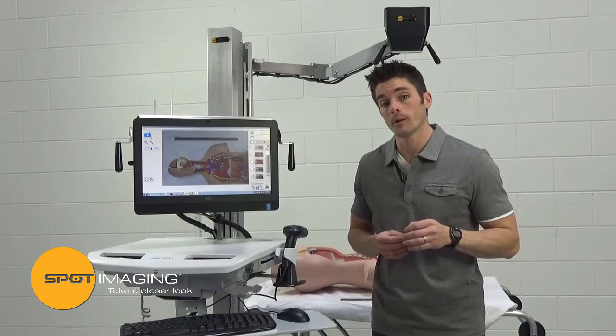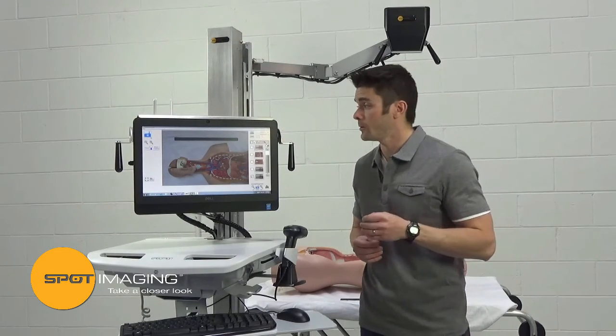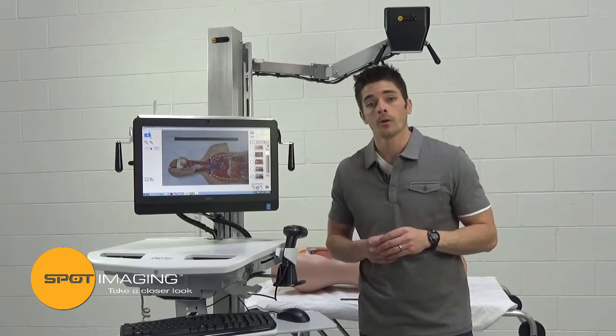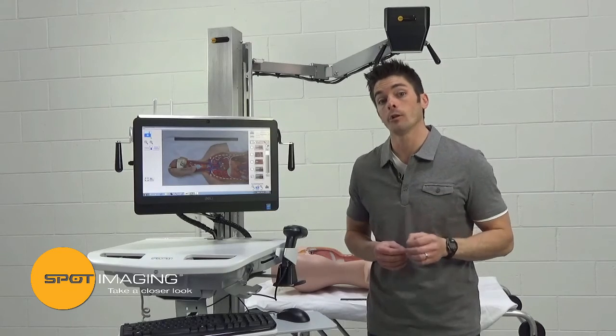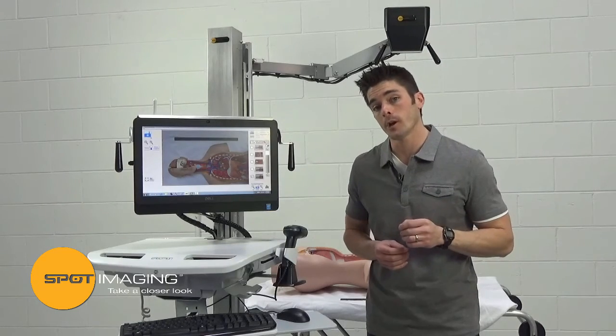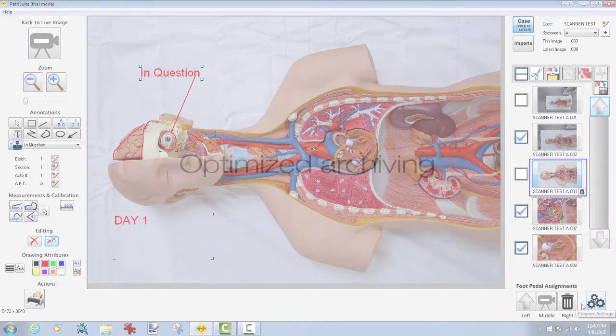PathSuite software allows for quick setting of calibration from a ruler in the field of view. Once completed, measurements can be immediately added, allowing for easy determination of tumor or organ size. Note that all annotations and measurements are stored in layers, allowing for easy editing and deletion later.